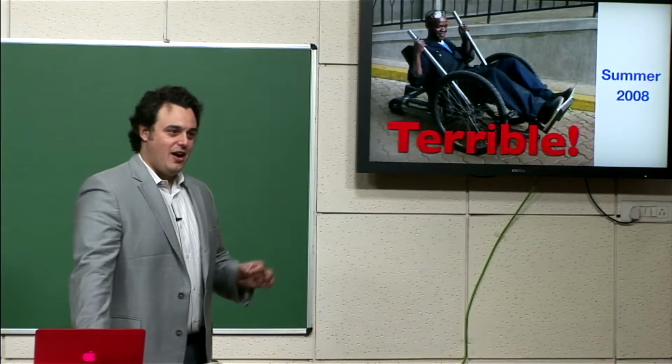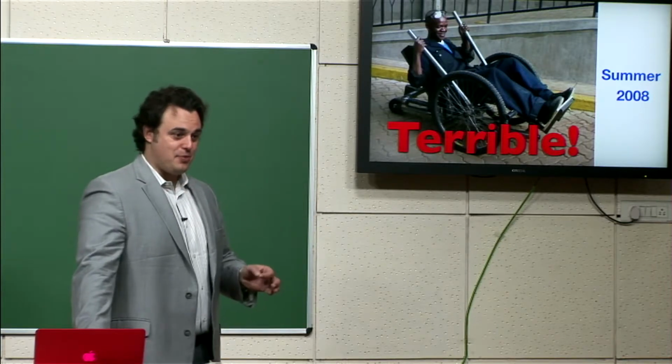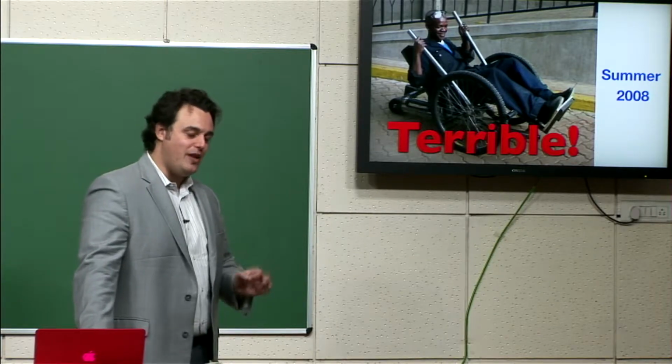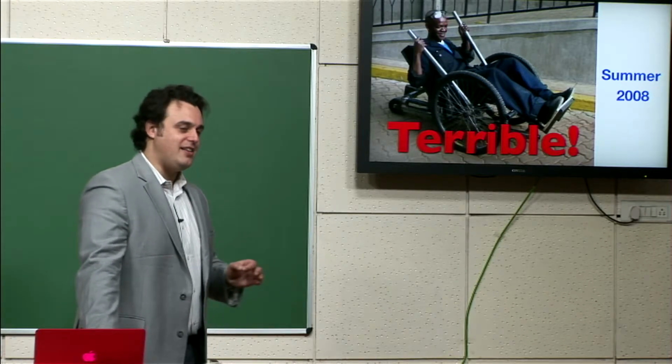And I'm showing you this because another thing I told you yesterday is fail early and often. I did all those calculations in the spring of 2008. We made the first prototypes in the summer. At the end of the summer, we went to the field and tested this and failed in context with people who know wheelchairs really well because they make them and use them, and understood why it doesn't work.